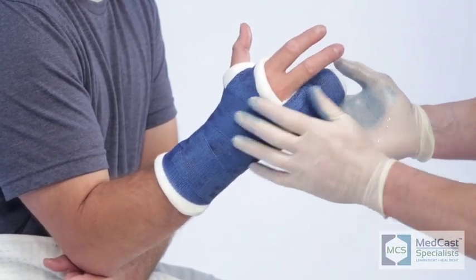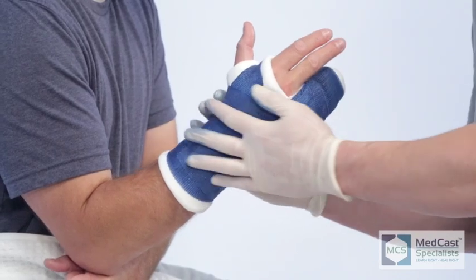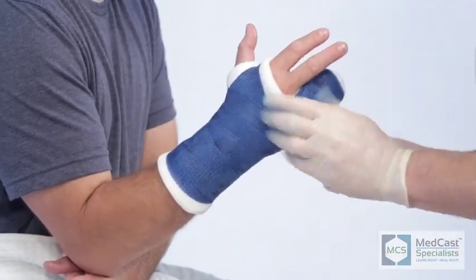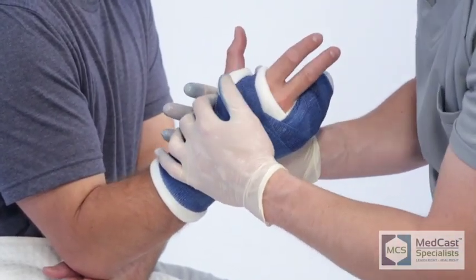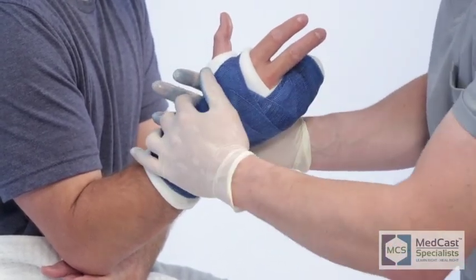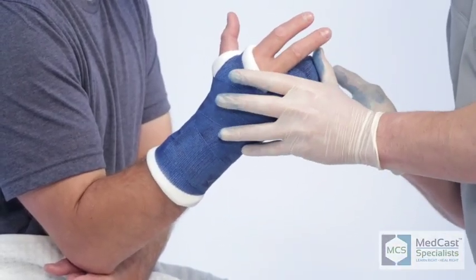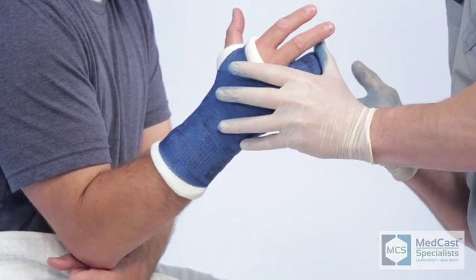At this point in the cast application, it's important to put a really good mold on the cast. We don't have the stability going up the forearm as with a short arm cast, so you've got to get a really good mold through the palm, wrist, and digits — this makes for a much better patient experience. Keep in mind the positioning: Intrinsic Plus — MCP joints at 90 degrees and the wrist in neutral or slight extension. This position will give the patient the best chance of regaining full range of motion when the cast is removed.